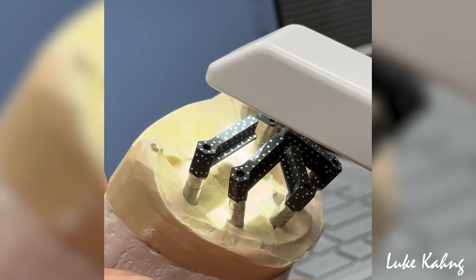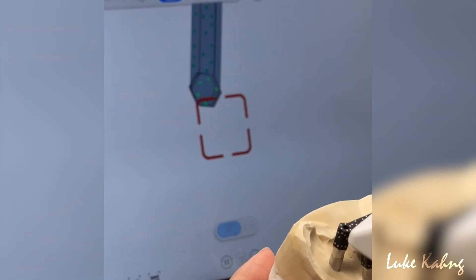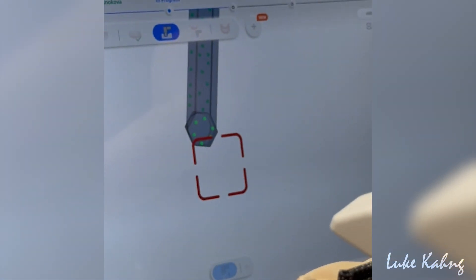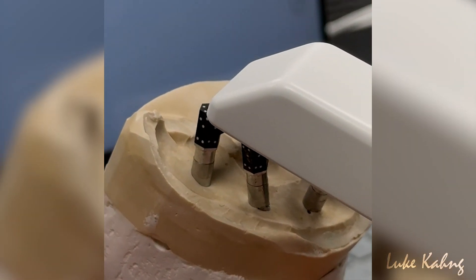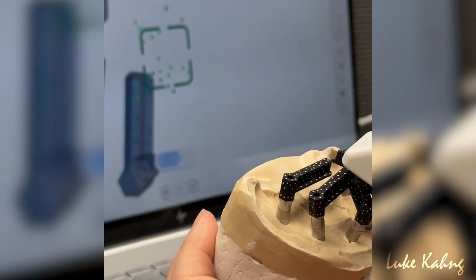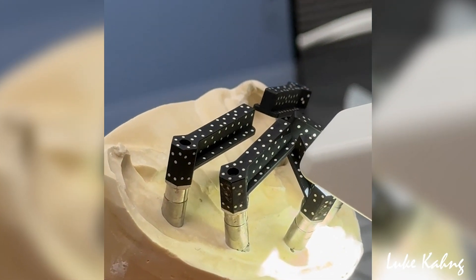You've got to go backwards, and then go from the back inside. The scanner's lost, so you've got to go back to where it knows it was. Go forward, then go this way, and keep tracing those dots. Now you go back forward and this way, then go back inwards.